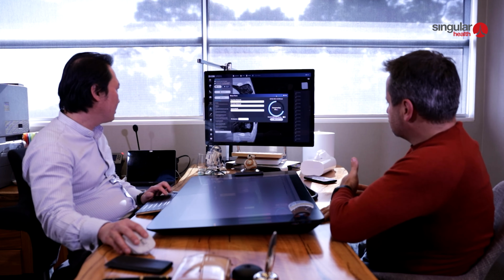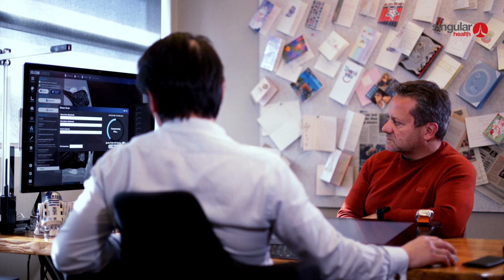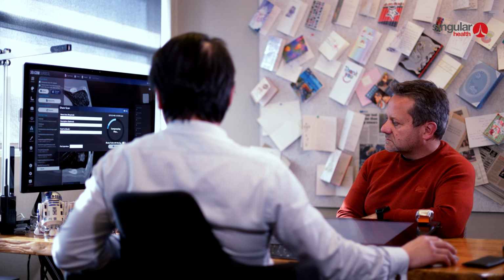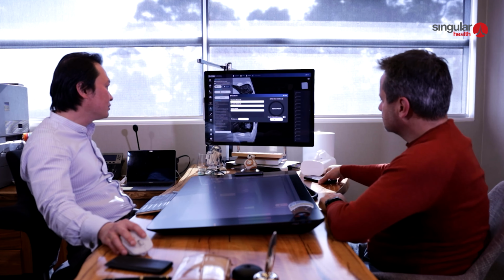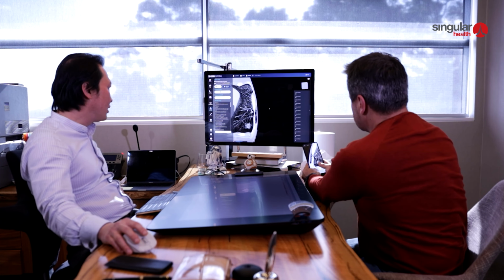Terrific, and that's just going to pop up in my email? Yep, it should pop up in your email, you open it, and it should ask you to download the application, and you should be able to see it on your phone. You can check once we've finished this, and we'll cut there. So if you now have a look at your phone, just double check that you've got that.